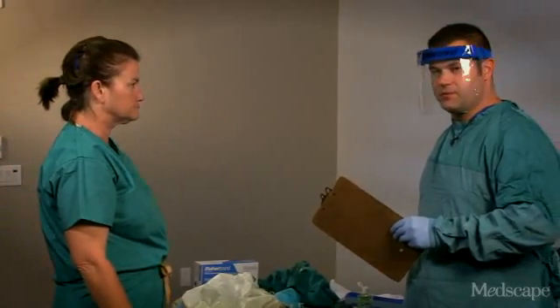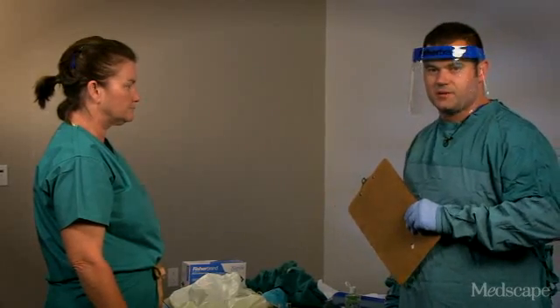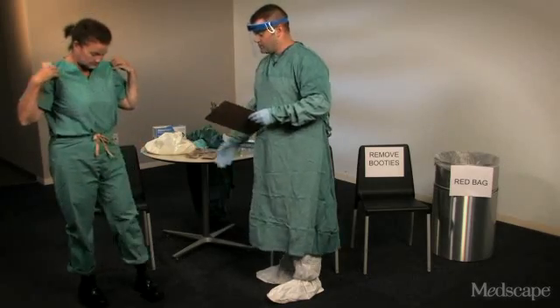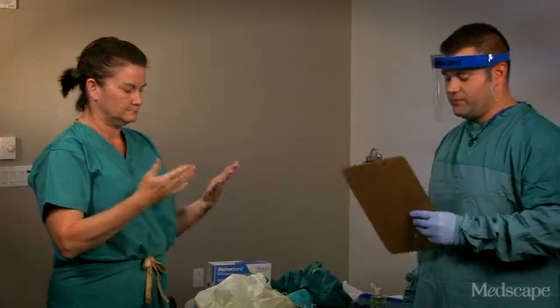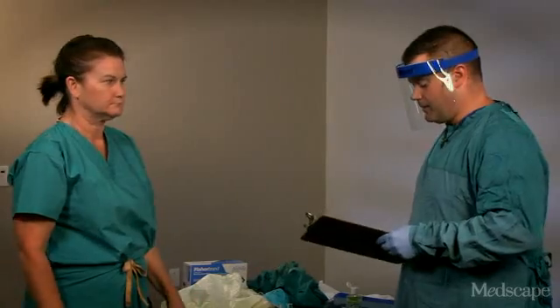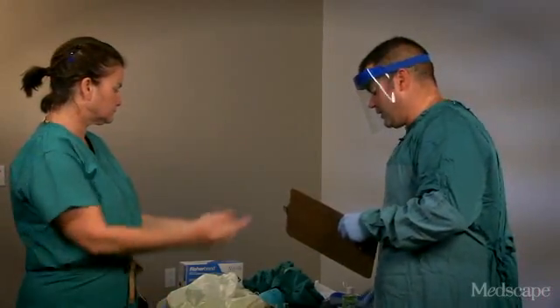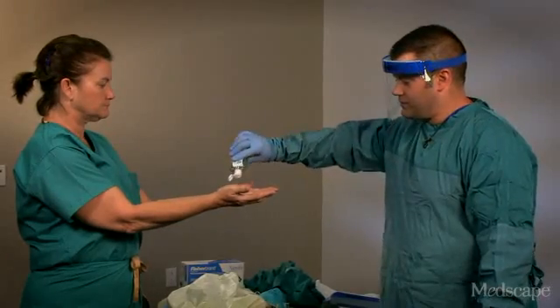Barbara is going to make sure that someone is supervising her. The person in that role should be trained on all aspects of PPE and infection control, and I will be representing the trained observer in this case. As her trainer, I'm going to make sure that she's wearing scrubs, washable footwear, and has removed all personal items such as jewelry, phones, and pens. Next, Barbara is going to clean her hands with alcohol-based hand sanitizer, which I will also refer to as hand hygiene.